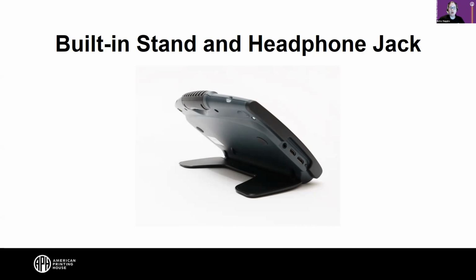Wonderful. And we also are pointing on this slide to the headphone jack. That's on the left-hand side of Juno. It's the top port, which is really fantastic. Students can have their headphones in and quietly listen to their materials in class. And it would be fantastic for adults on the go who need that extra bit of speech support to be able to discreetly listen to documents without anybody listening in.